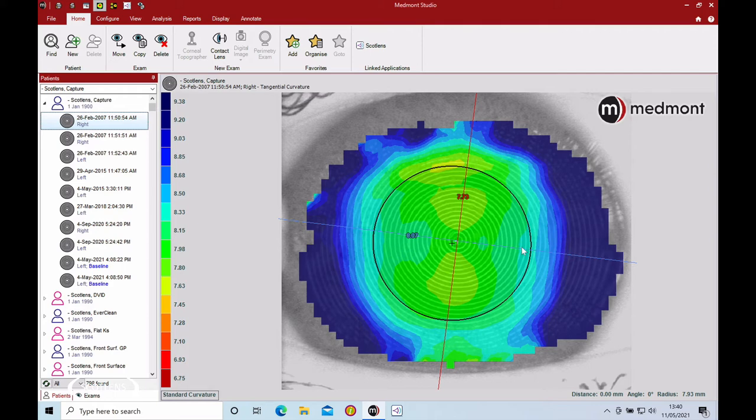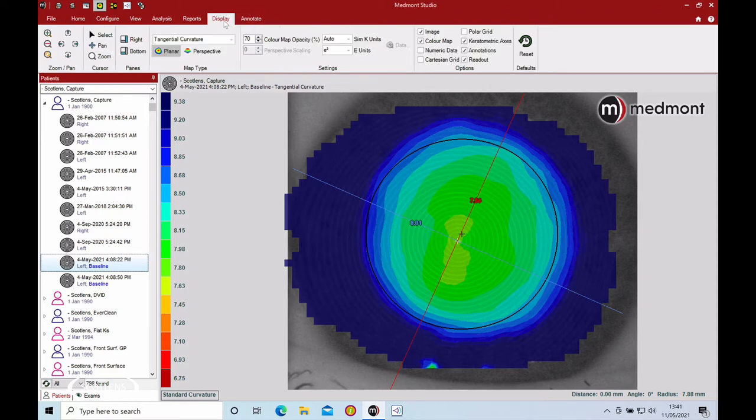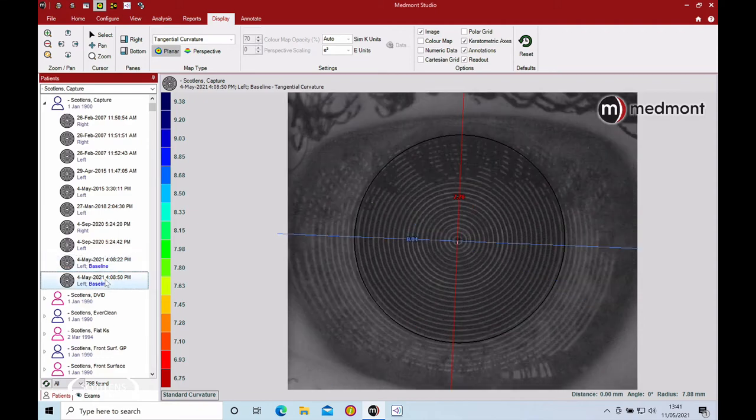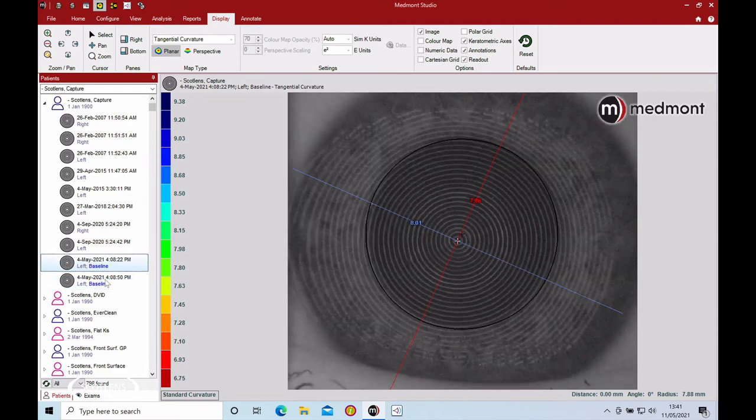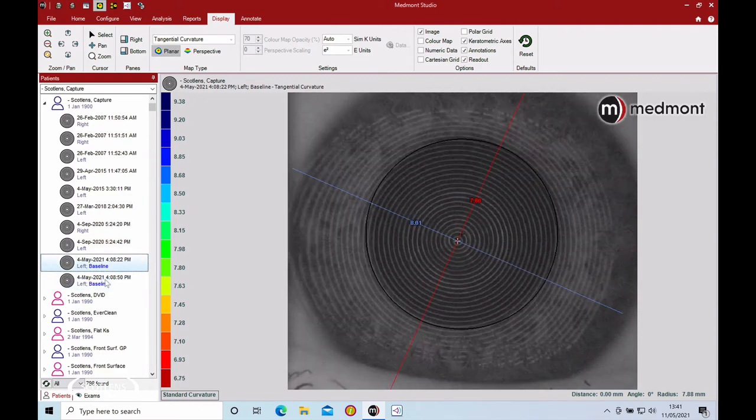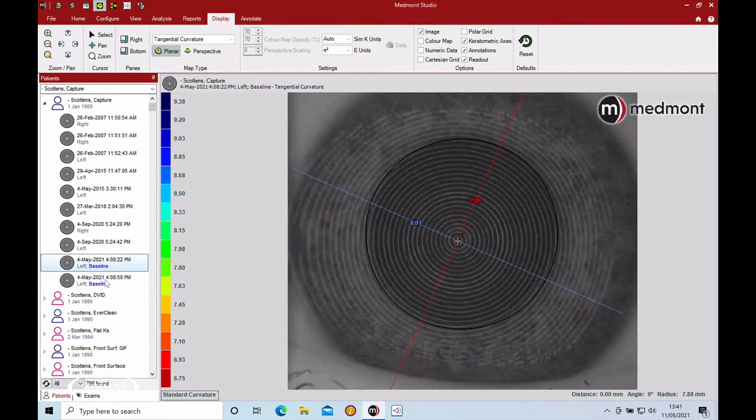Once you've got your capture, let's have a look at a few images. Let's take the color image off and look at the placido image first. You can see this first one and the second one, it's the same patient just a few seconds apart, and we can see there is a difference between the two images at the top.